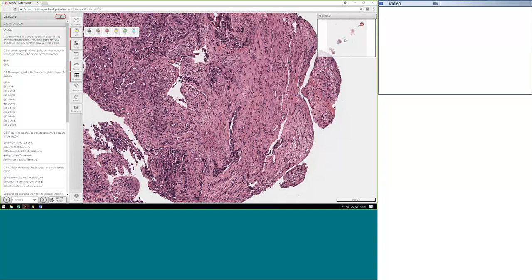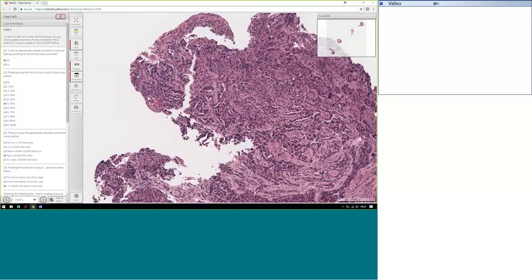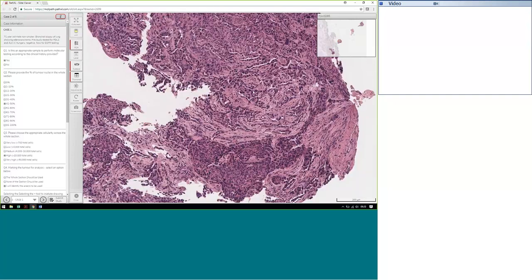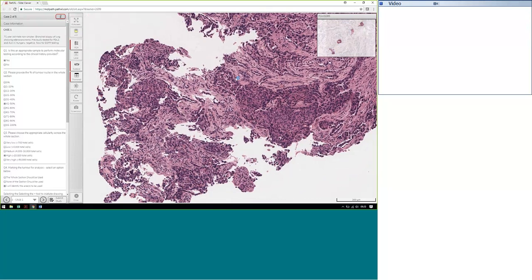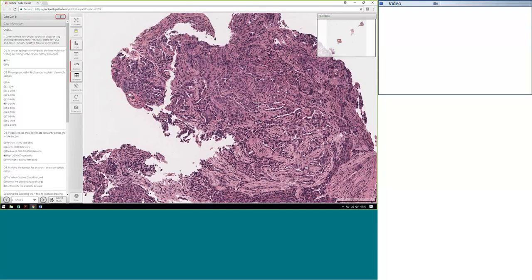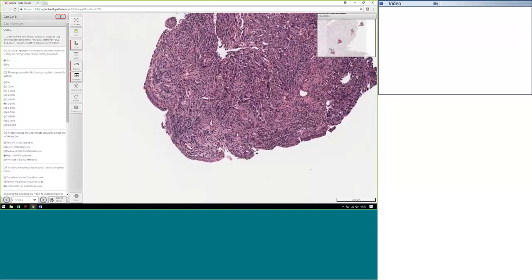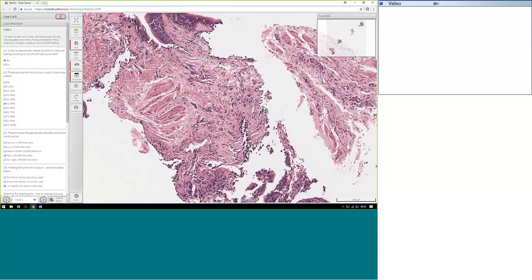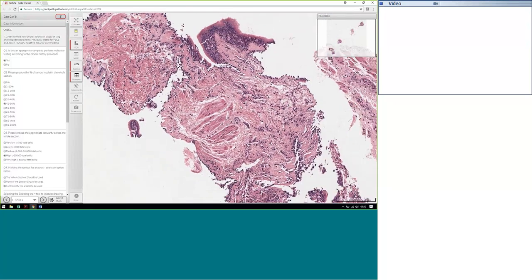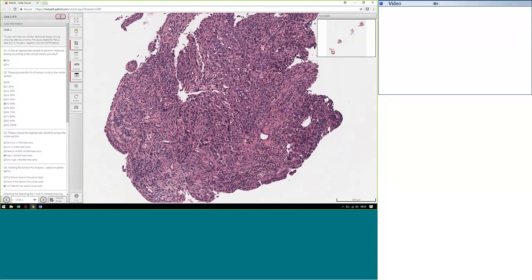Jane? I totally agree with everything, Perry. I would just say that it will be difficult to enrich to get it to 40% because there's no clear areas of inflammatory cells or desmoplasia that you could remove, although possibly cutting the ends off the endoscopic forceps pieces might be a possibility to get up to 40%. But there's plenty of tumour spread around. Yes, this sort of material could always be sacrificed on this fourth piece, but it's a bit richer in tumour content in this portion than the others.